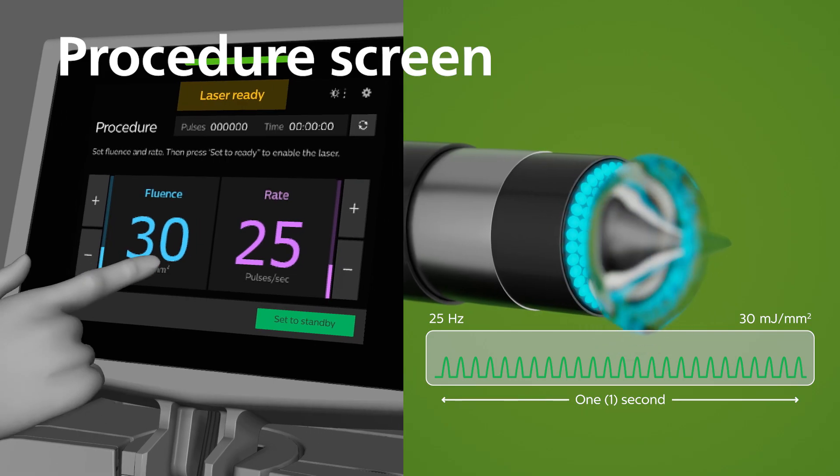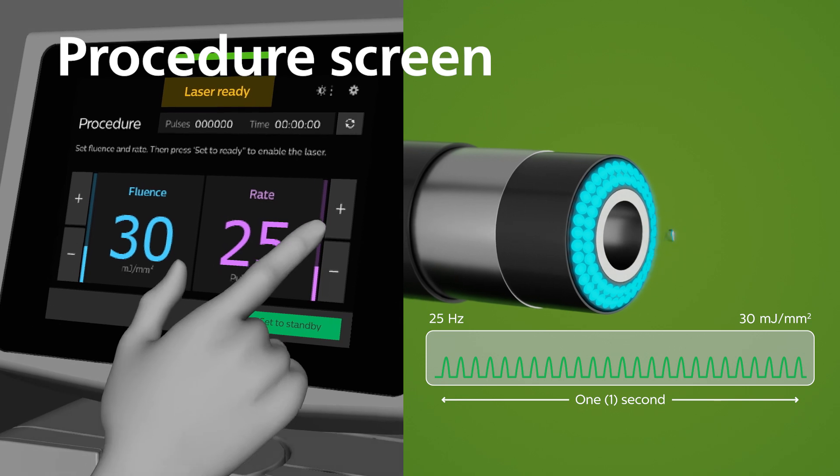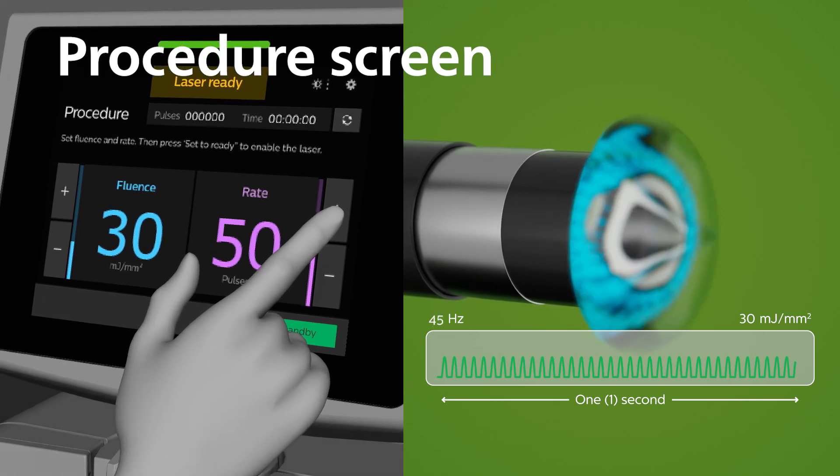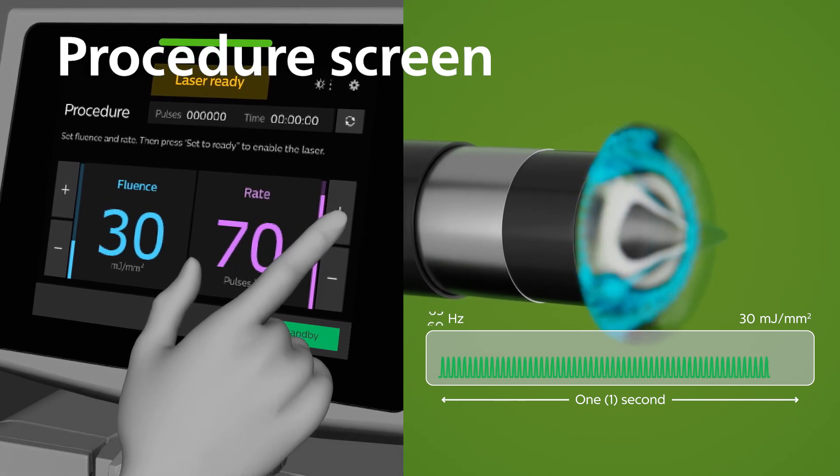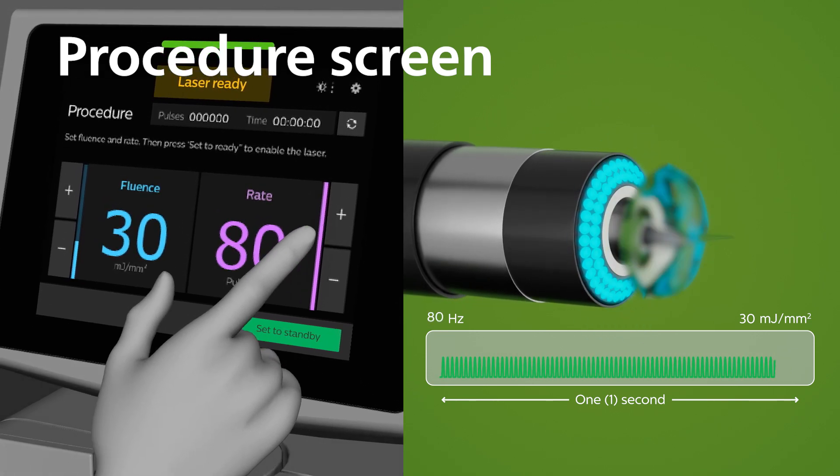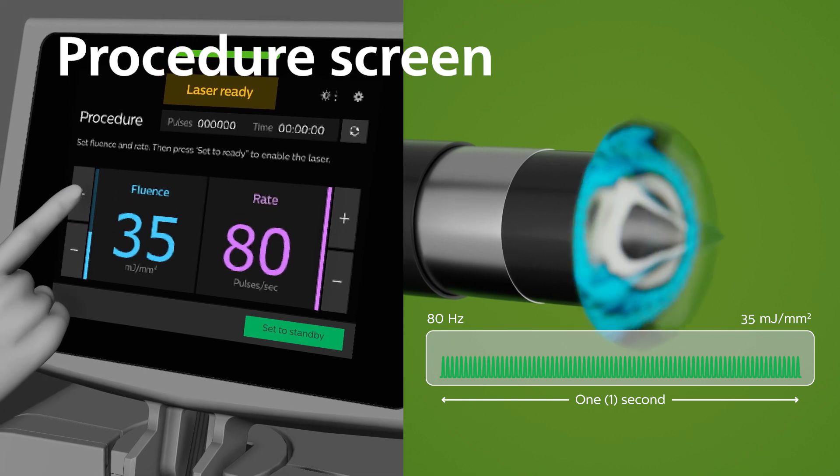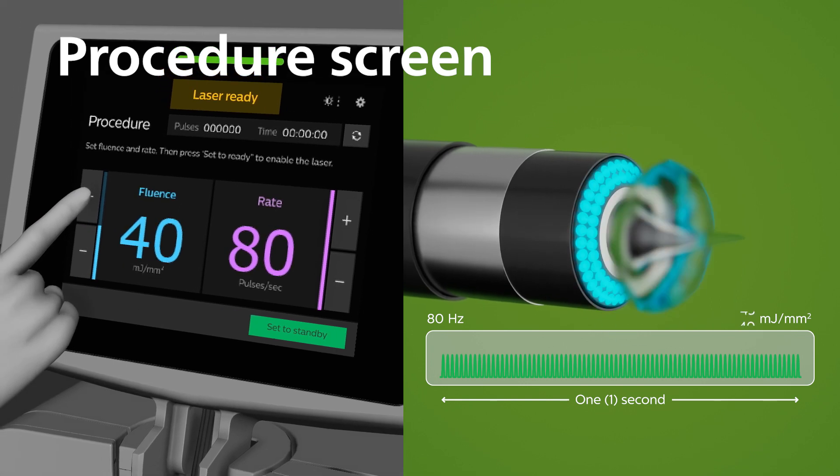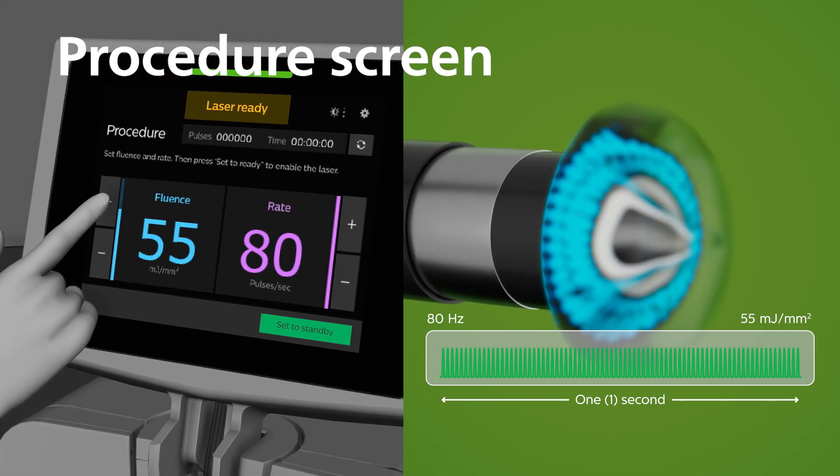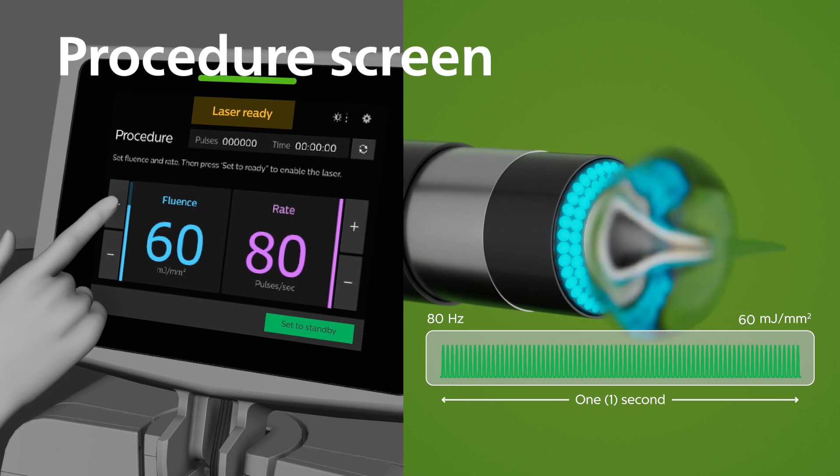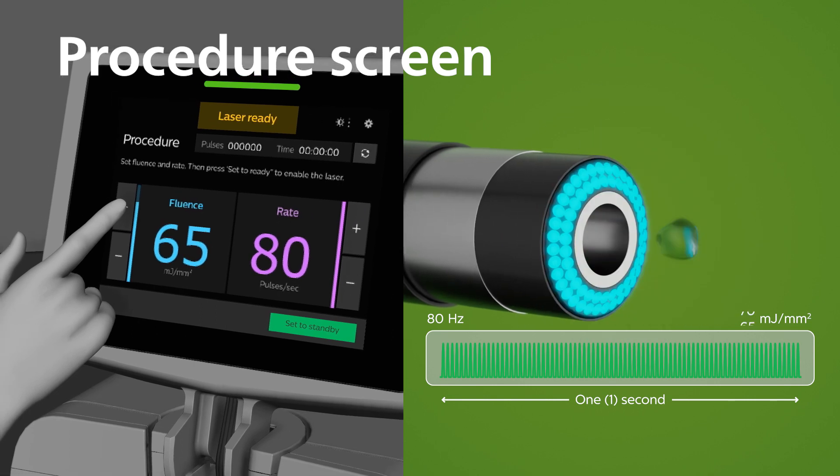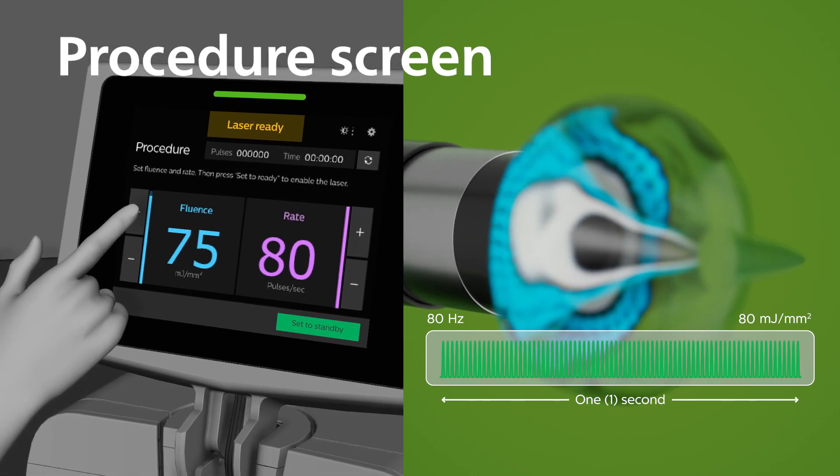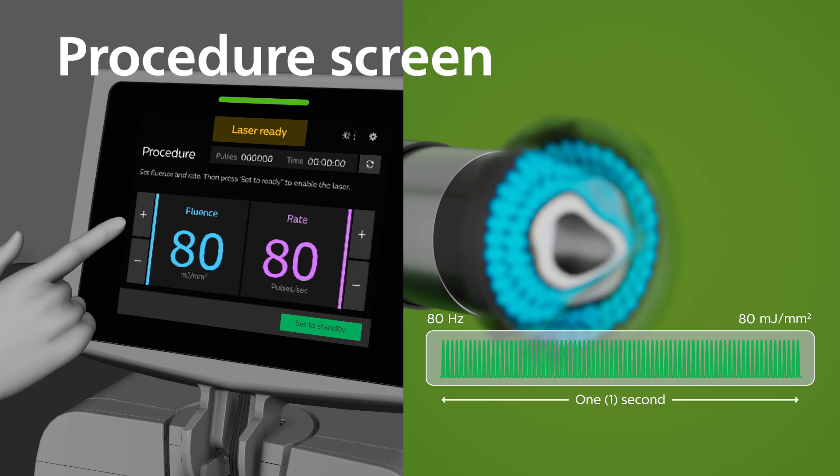The Rate button adjusts the pulse repetition rate in increments of 5. The repetition rate is visible in the display window. The Fluence button adjusts the output energy in increments of 5. The current Fluence value is visible in the display window.